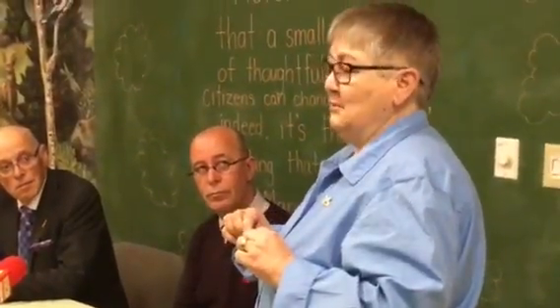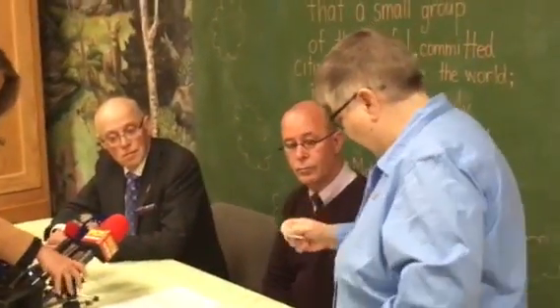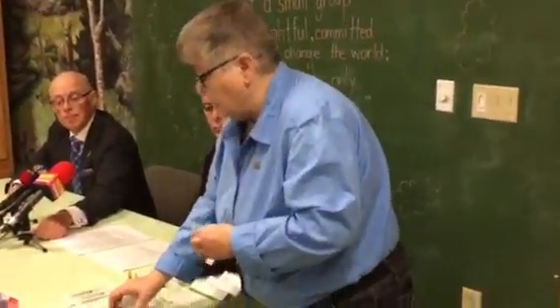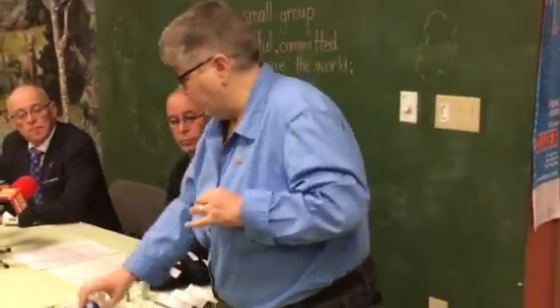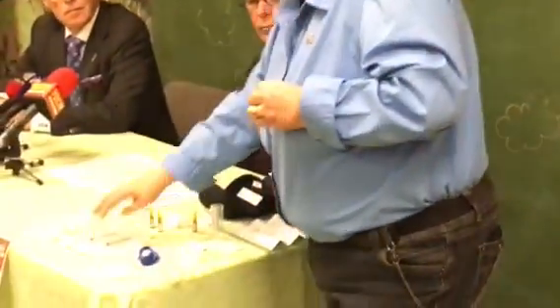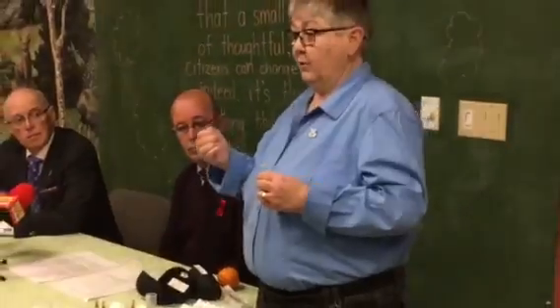We provide these alcohol wipes, not for the purpose that you would think, because naloxone is an emergency approach. We don't wipe the skin. We go right through clothes, just like an EpiPen, so that it will take effect as fast as it can. So we include these for snapping the vial, so you don't cut yourself. You just wrap it around there, and I'll do it in a second. There's a breathing apparatus to put over the individual's mouth, a pair of gloves if you have the time and inclination, and 2 vanishing point syringes. The most important thing about this kit, besides the naloxone itself, is the fact that the tip disappears once it's fully deployed, so there's no risk at all of an accidental needle stick when you use this type of needle.